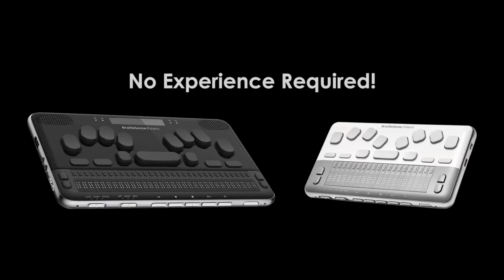If you find yourself having any trouble understanding which keys to press when I talk about keystrokes, such as the F3 button, I recommend that you check out our Polaris Essentials Hardware Overview video, which gives a complete physical description of the Polaris. So let's get started.